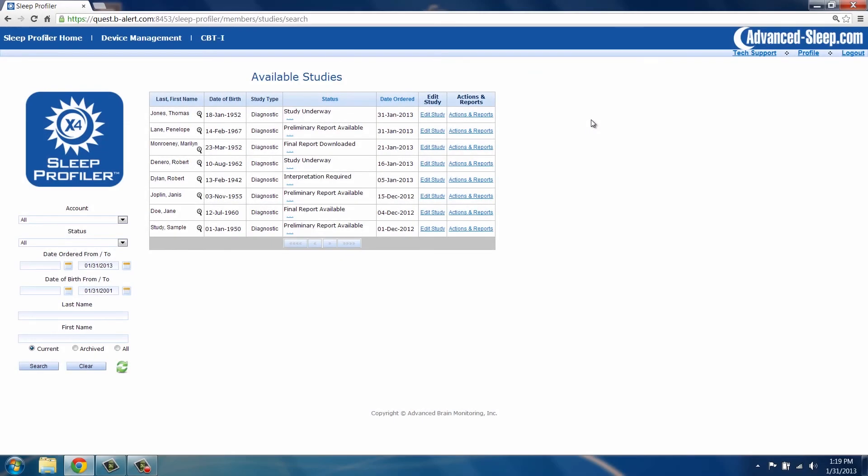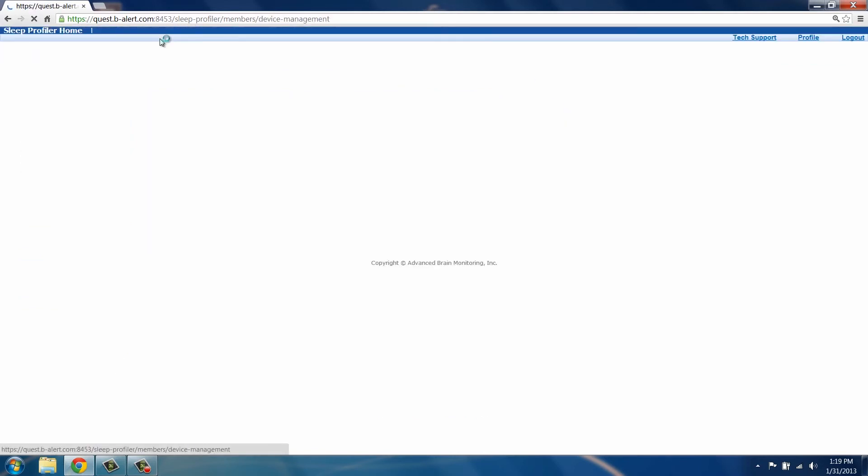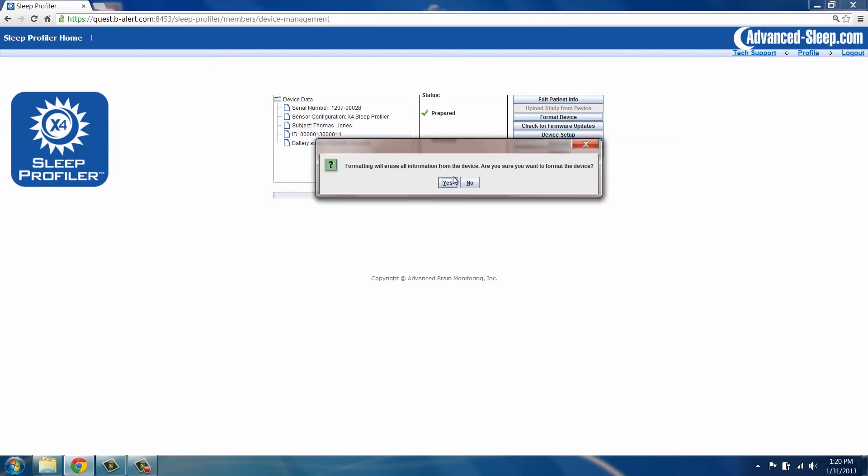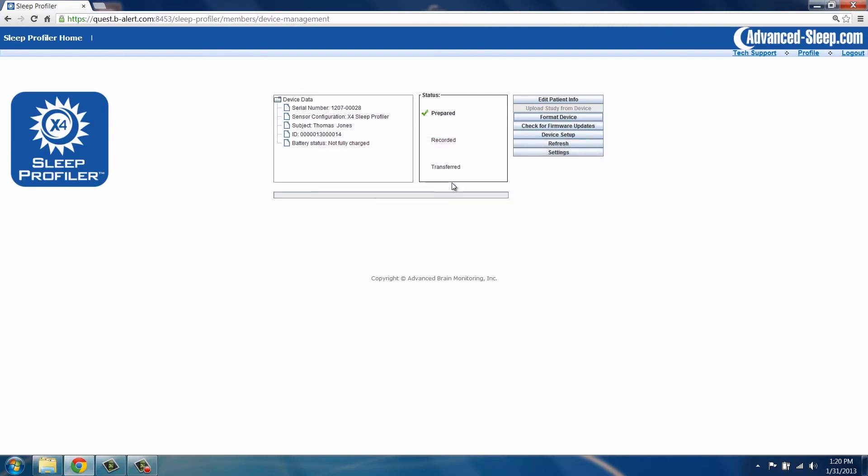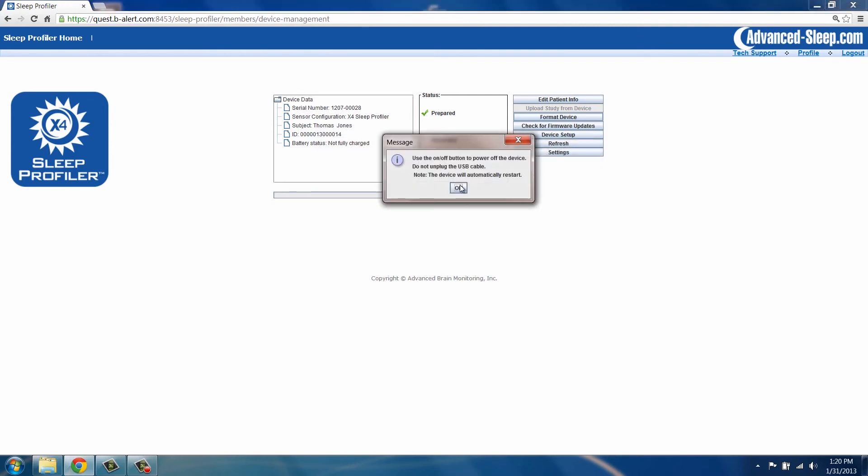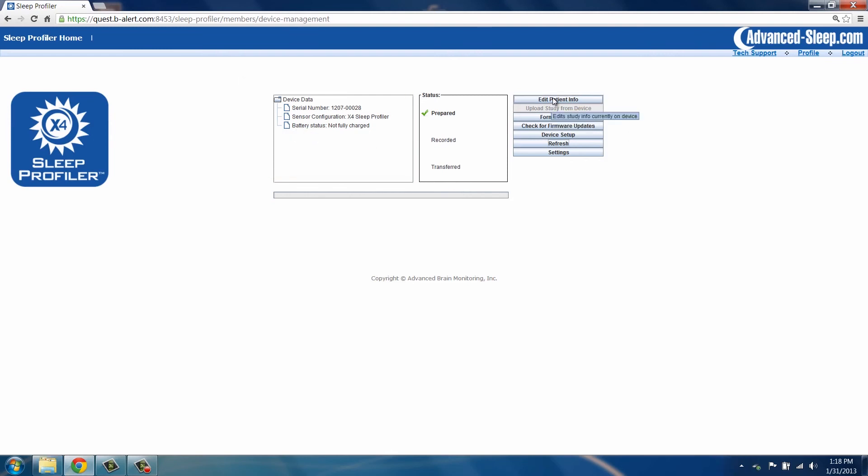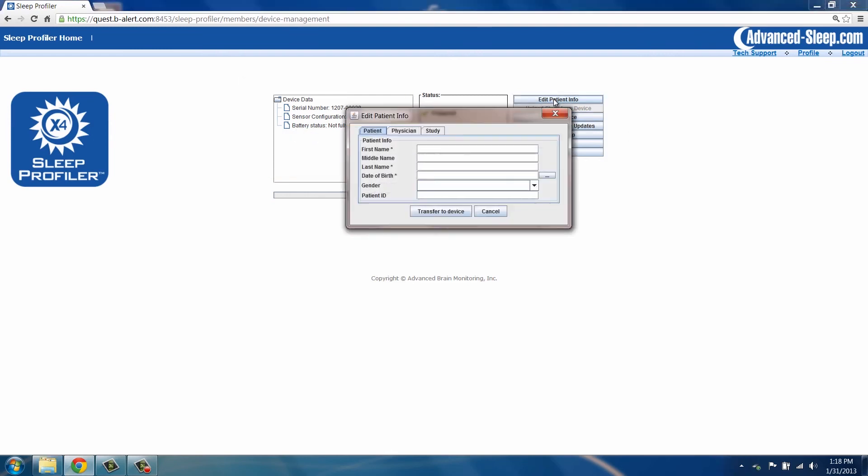To do this, with the device plugged into the computer, select Device Management and then click on Format Device. Select Yes to format and then click OK and turn the device off when indicated. The study number is now removed from the device and the device can be assigned to a new patient.